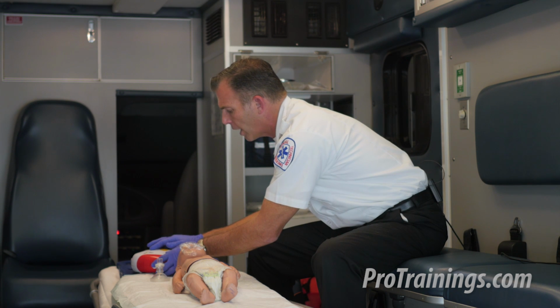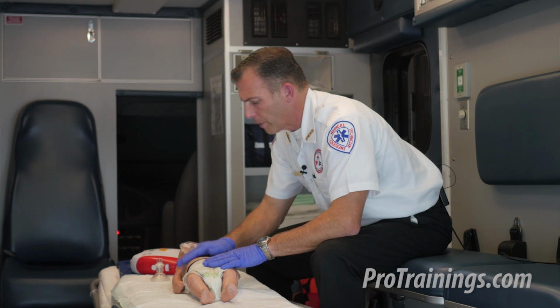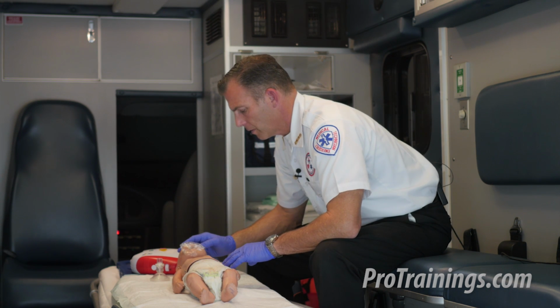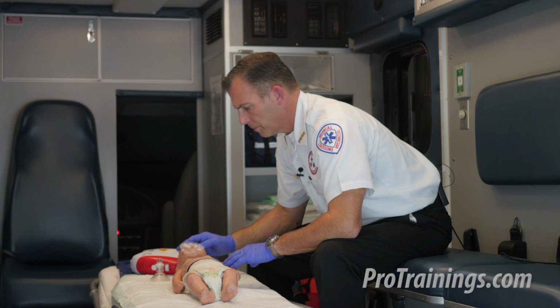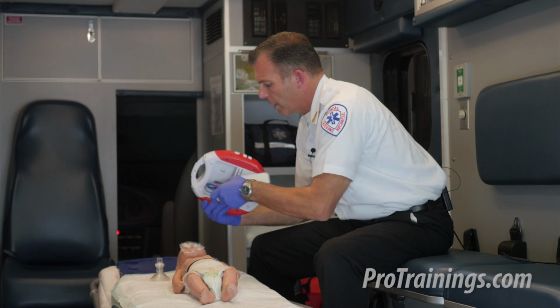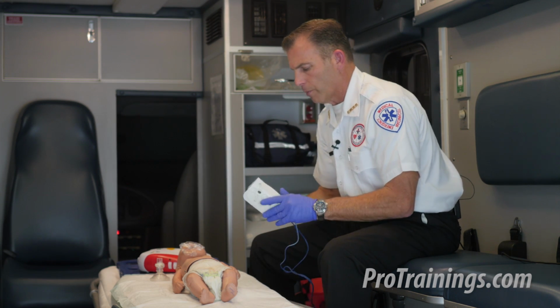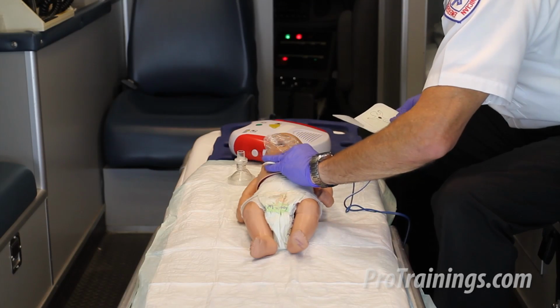Pushing the power button on. Remove clothing from person's chest. I remove the clothing, pat them dry if they're damp. Attach pads firmly to person's chest as shown. If there's infant pads for this infant patient, I'm going to use them, and they are here, so I'm going to use infant pads. Stick one to the chest on the front.